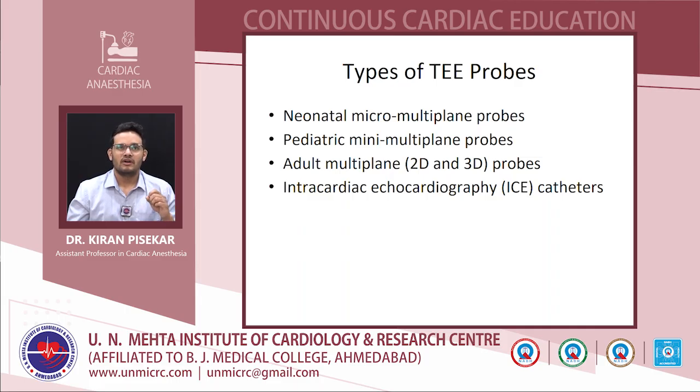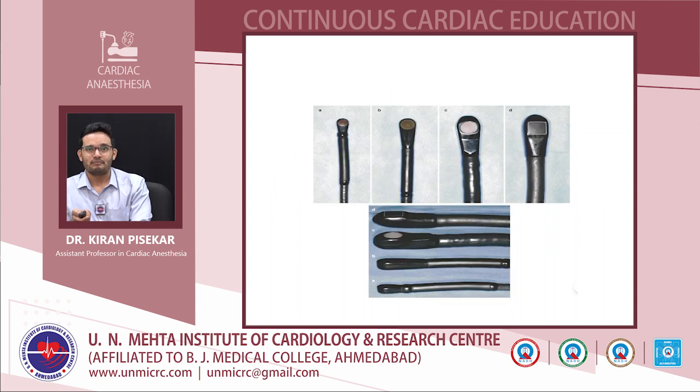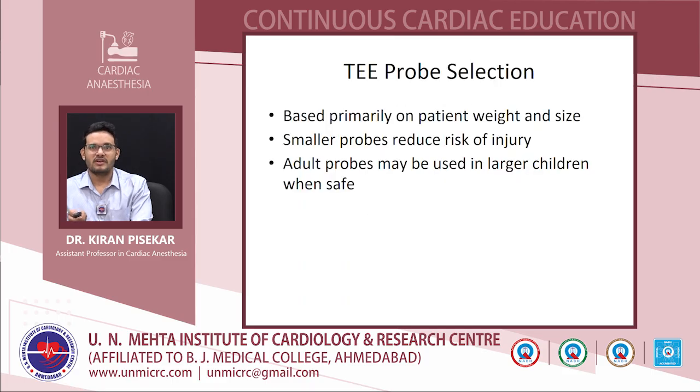If we try to insert a pediatric TEE probe in a neonate, there can be bronchial compression, or in case of TAPVC there can be obstruction of the common chamber. In order to avoid that, the newer neonatal TEE probes have come up, which are just about 5 mm in diameter. So these are the various sizes and various types of TEE probe.